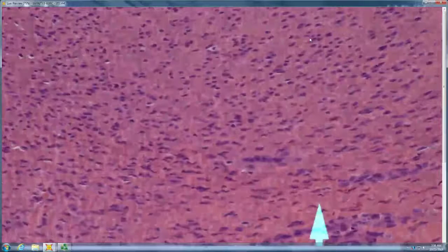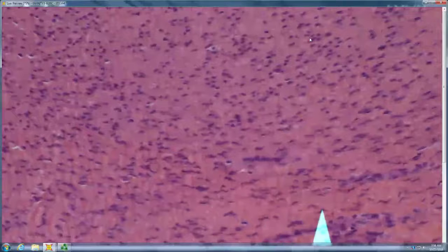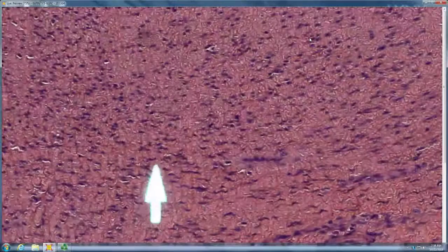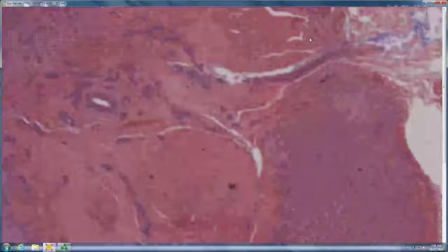Can it be just fibromatosis? Yeah. You see the corkscrew myofibroblasts when you put down your condenser. You see the collagen is corkscrew as well, right? So that goes with myofibroblastic. And nodules, really well-defined nodules of fibromatosis like this, would be typically what location?